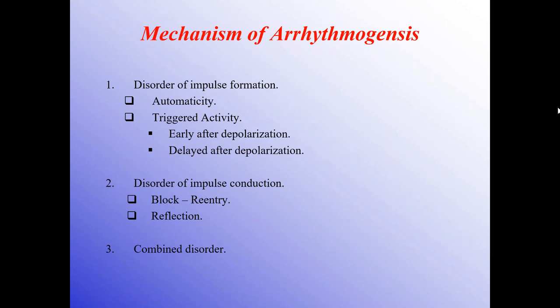Very good. Once again, very good. See, when you have the sinus rhythm, you will have a P wave, a QRS, and a T wave. The P wave is a much sharper wave. But the T wave will be appreciated once the patient goes into tachycardia. The way to differentiate is that you will have to have a visual impression of the P and the T wave in the sinus rhythm. Once you have that visual impression very clear, when you have the patient in tachycardia, you'll be able to appreciate whether the wave you are seeing in the tachycardia resembles the P wave or the T wave. So the differentiation has to come from the sinus rhythm ECG, which should be available with you, if you want to differentiate that.